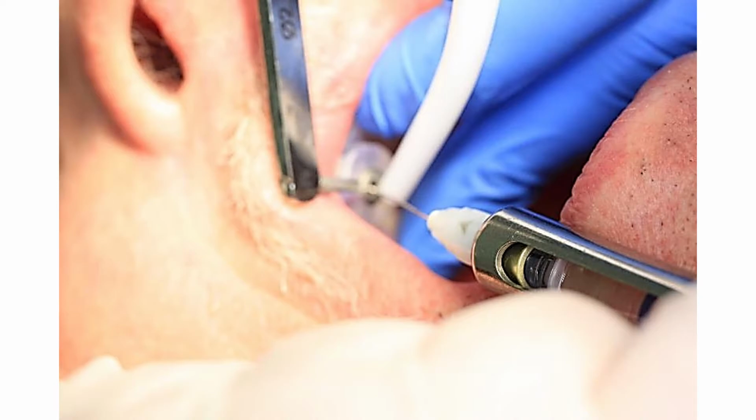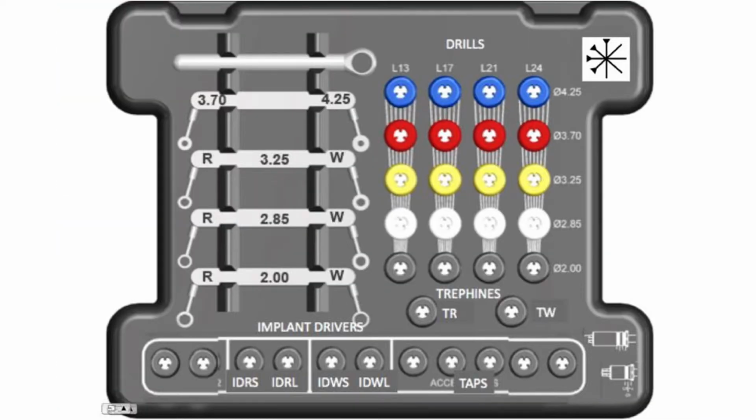If you do decide the patient needs greater anaesthesia, then you do an infiltration buccally and an infiltration lingually. There is no need to use any blocks in this procedure. So you will place 2 mils of local anaesthetic, normally lignocaine and adrenaline 1 in 80,000 if that's available in your region, and the same 2 millilitres of local anaesthetic to the lingual side.